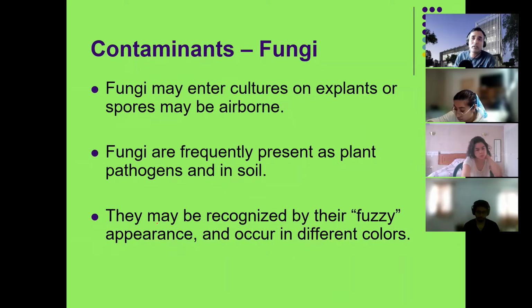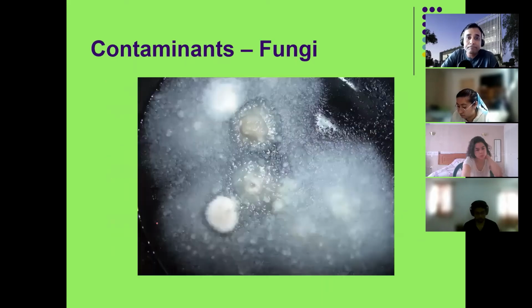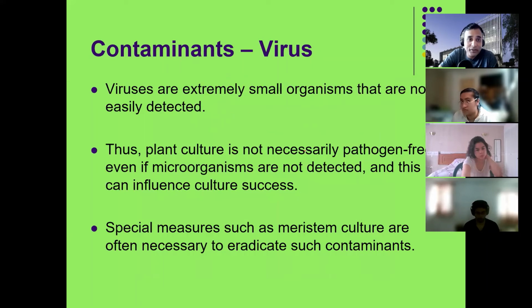If your lab is not in good dry conditions, fungi will be anywhere: on the floor, on the walls, in the cleaning room, or from outside, from the soil, or even within the tissue. A fungus looks like this. This is a normal fungal mildew, and you can see how it grows. Within 1 day, 2 days, it will cover your flask. They grow extremely fast.